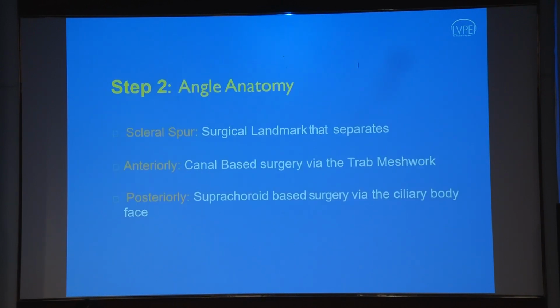About angle anatomy, it's very important to identify the scleral spur, which is the surgical landmark that separates anteriorly the canal-based surgeries via the trabecular meshwork, and posteriorly the suprachoroidal-based surgery via the ciliary body face.